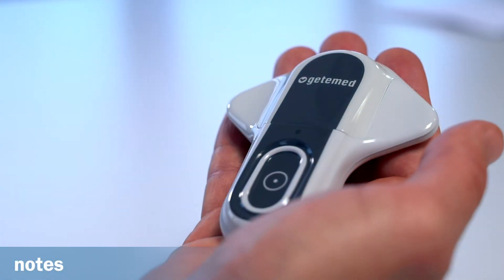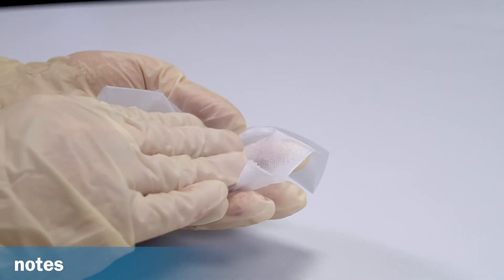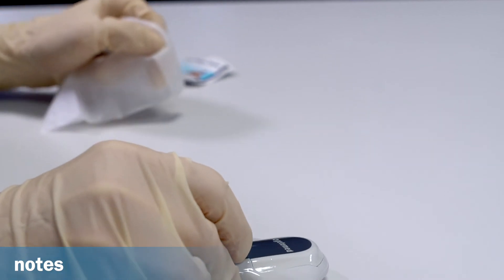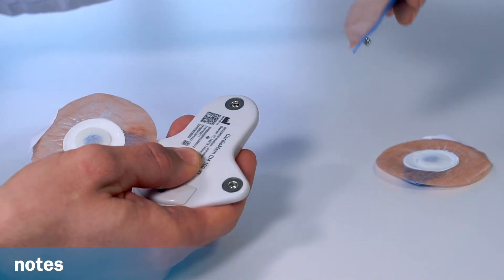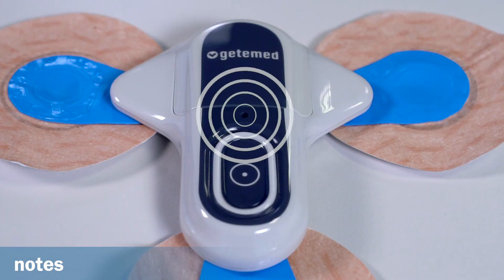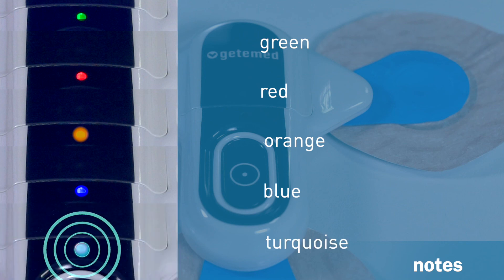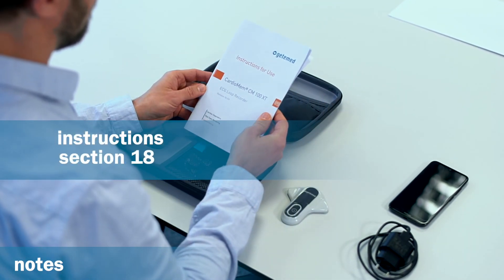Finally, a few important notes. The recorder must be disinfected immediately after receiving it back from the patient and before passing it on to the next patient. We recommend wiping it with a solution containing at least 70% alcohol, such as Sterillium. To ensure good signal quality, we recommend changing the electrodes every two to three days. The light indicator has different colours for different operating states of the recorder: green, red, orange, blue, and turquoise. The meaning of the individual colours and the accompanying beep sounds are provided in the instructions for use in Section 18.